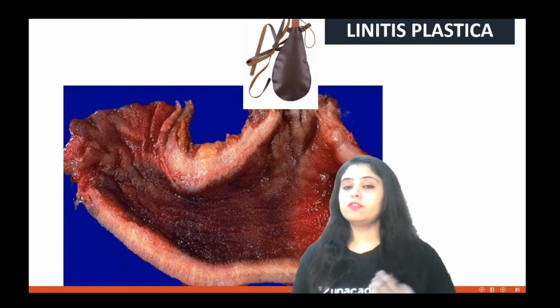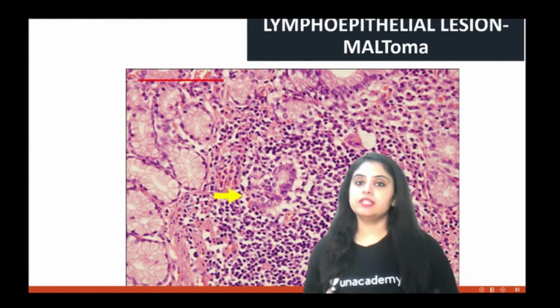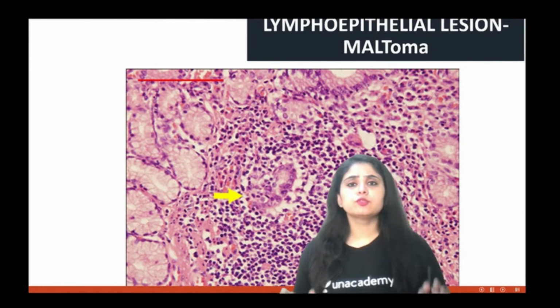Okay, now let's move on from here to another tumor of the stomach. Now beginning with the next tumor of the stomach, and that is a maltoma. First and foremost, what is the full form?